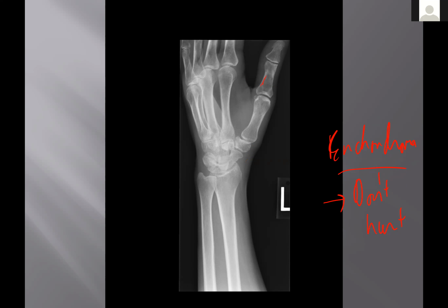So like a giant cell tumor? Well, giant cell tumors can occur in the hands. They're not very common, but here's the lesson for you, by way of review. If you think somebody's got an enchondroma in the hands, but it hurts, it's probably not an enchondroma.